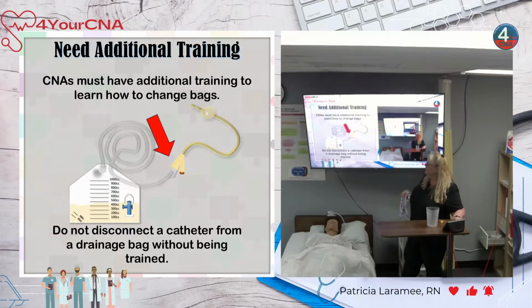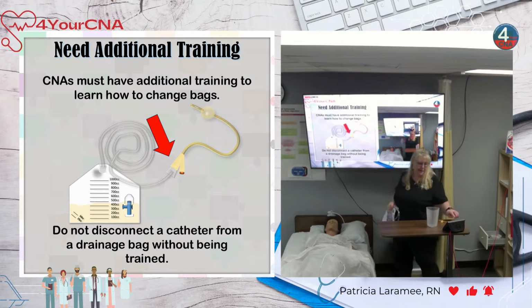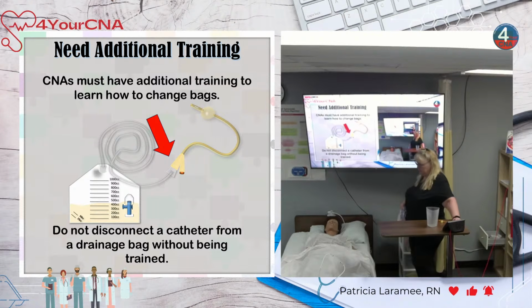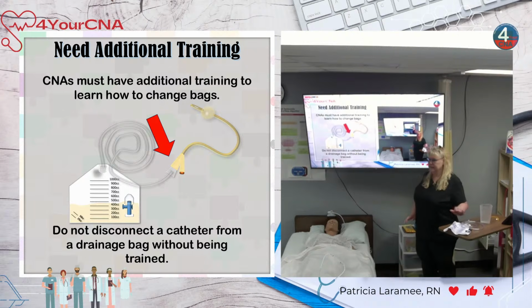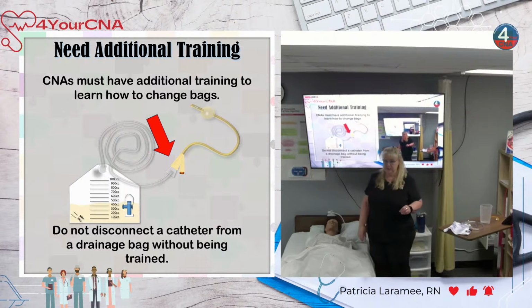Okay. CNAs are going to learn how to empty the bag. You can learn how to change the bag with additional training. Do not disconnect a catheter from a drainage bag without being trained. The reason that I keep going over this and over this is because during the exam, a lot of students will disconnect the catheter from the bag and take the bag to the bathroom to empty it.